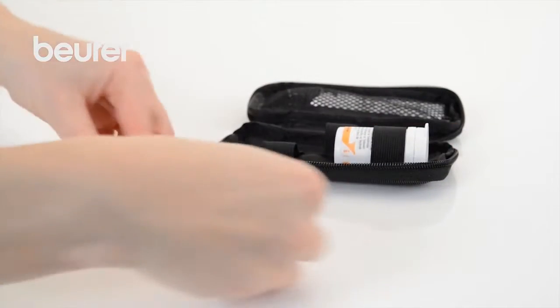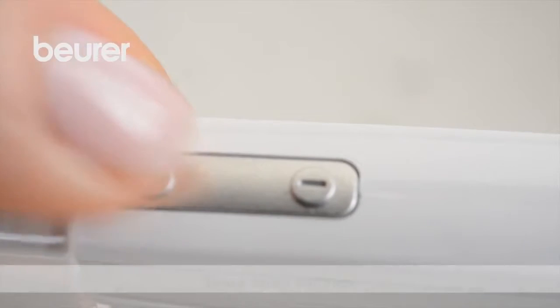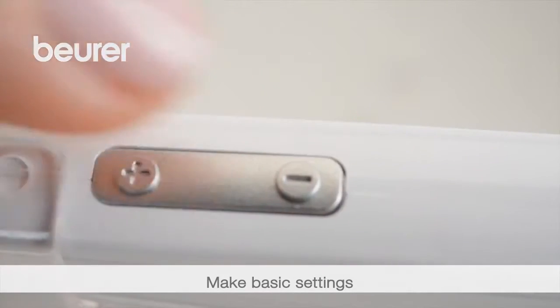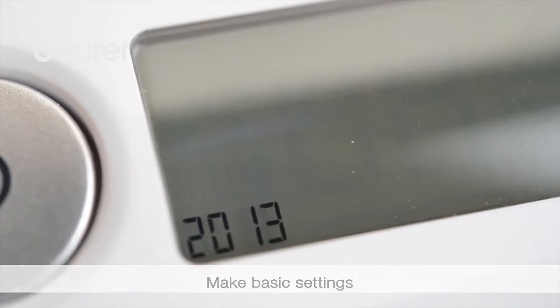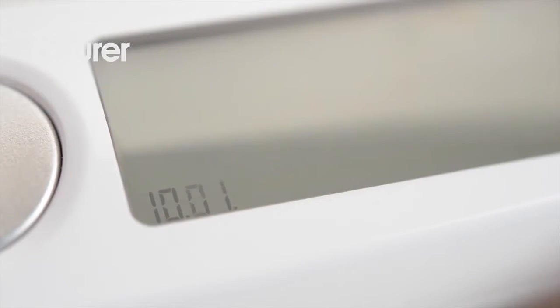Remove the battery insulating strip. Use the plus and minus buttons to set the year, then press on-off to confirm the setting. Use the same procedure to set the day, months, hour and minute display, the acoustic signal and the backlighting.